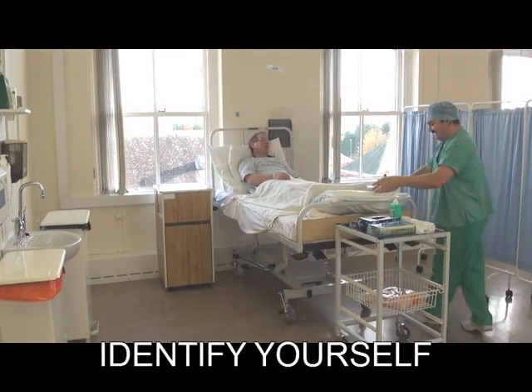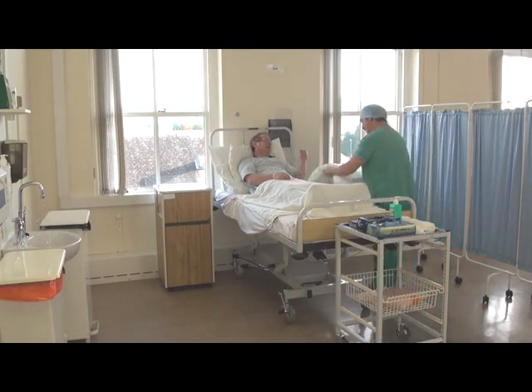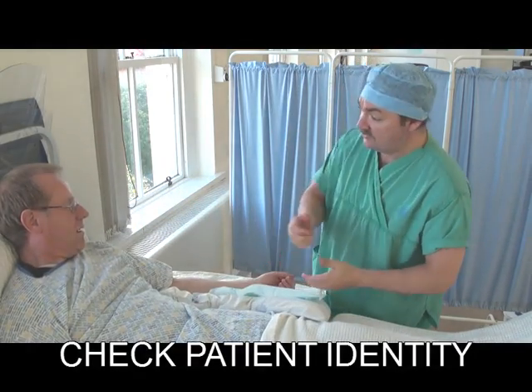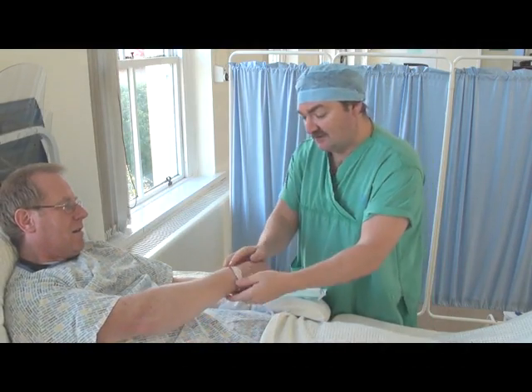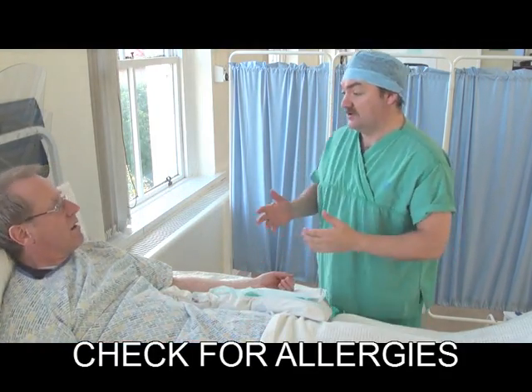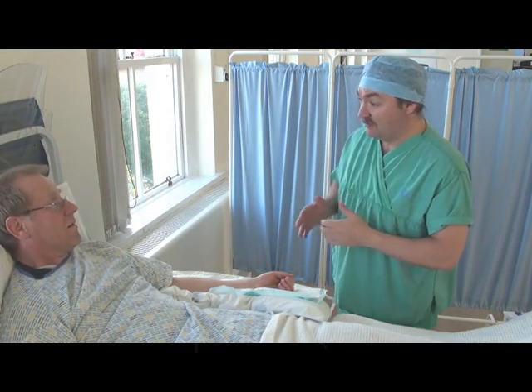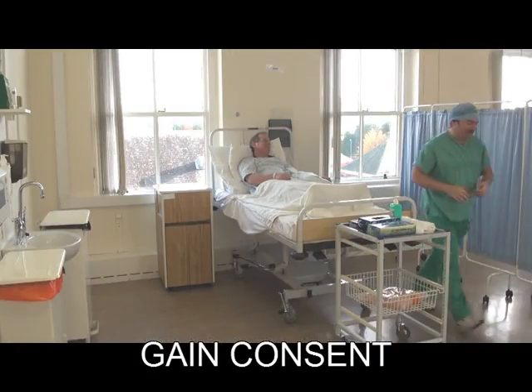Introduce yourself to the patient and position the arm comfortably on a pillow. Next, verify the patient's identity by checking the ID bracelet for name and date of birth. Also check for any allergies. Explain the procedure fully to the patient. It's important to obtain verbal and valid consent.